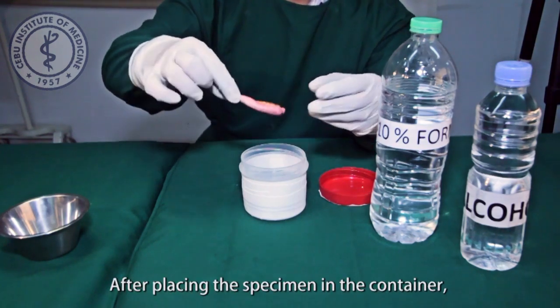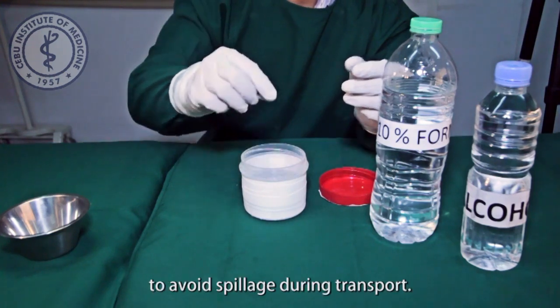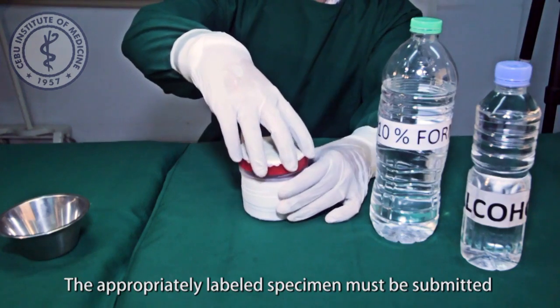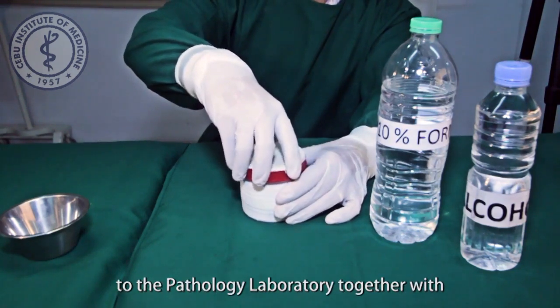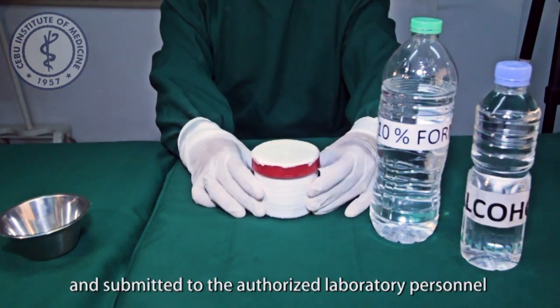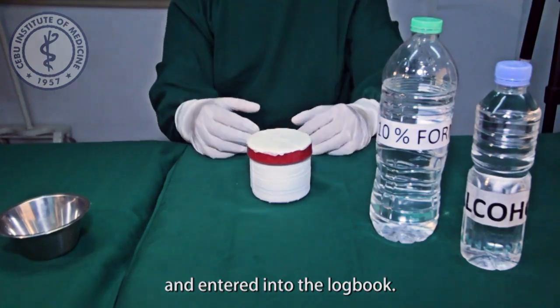After placing the specimen in the container, it has to be covered and sealed to avoid spillage during transport. The appropriate labeled specimen must be submitted to the pathology laboratory together with a complete request form and submitted to the authorized laboratory personnel and entered into the logbook.